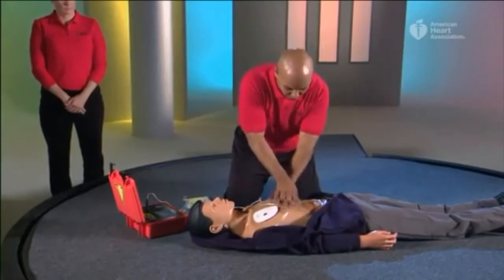After the shock is delivered, begin CPR starting with compressions. Remember that the first compressions are the most effective and become less effective over time. If another trained person is present, switch rescuers at least every two minutes, even if you're not tired, to ensure good CPR quality. While resting, give feedback to the other rescuer to help make sure they push hard and fast.